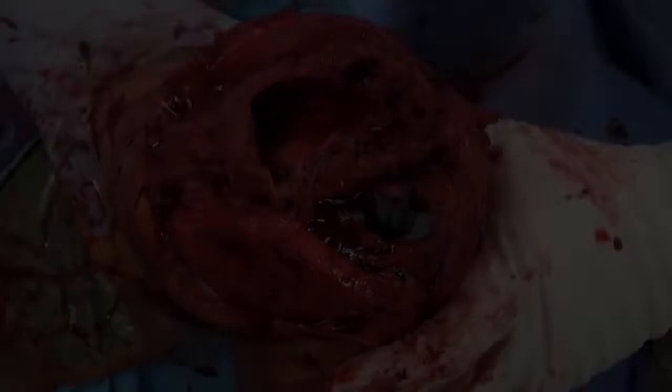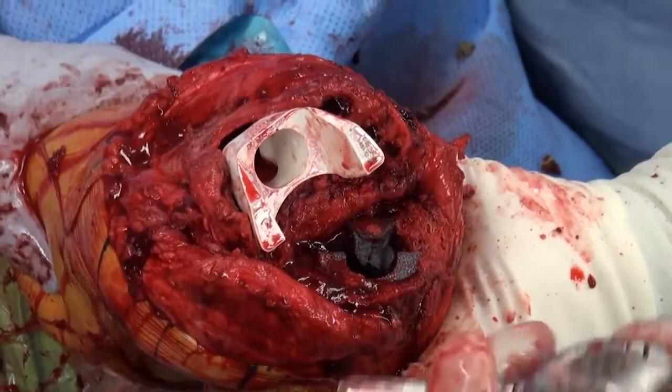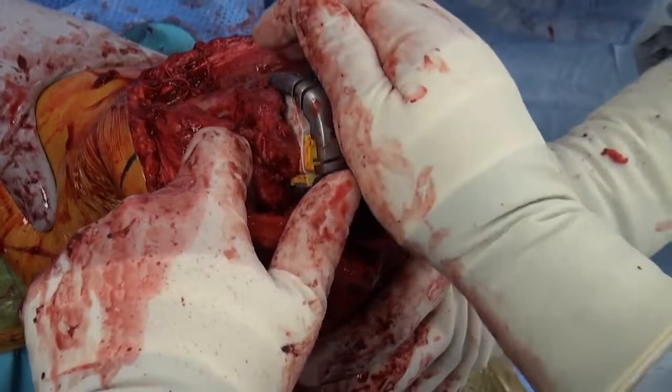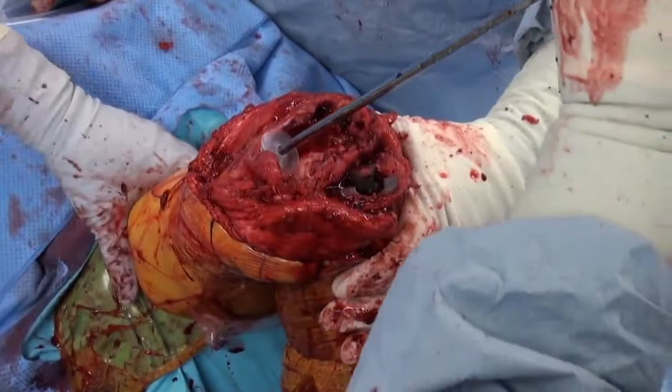After repeated efforts with the burr, a satisfactory level of insertion of the cone is achieved. The trial is placed and can be used as the final impactor for seating of the cone and ultimately the real porous tantalum cone implant. This shows final placement at the proposed level, and a check of rotational stability, which is excellent, as well as axial support having been established by the trial cone. A plug is placed into the canal prior to placing the real porous tantalum cone.